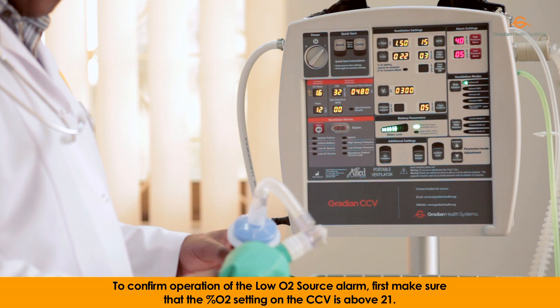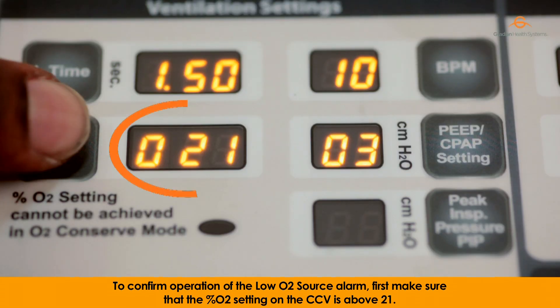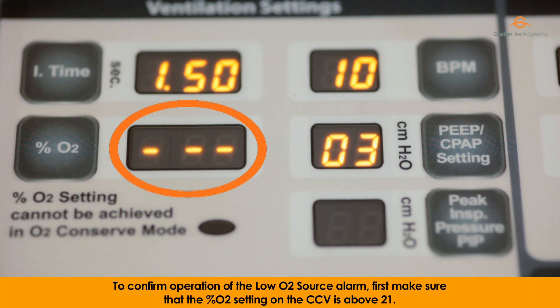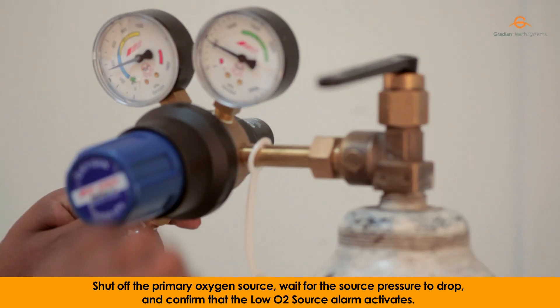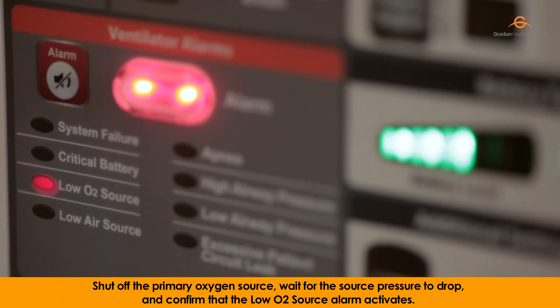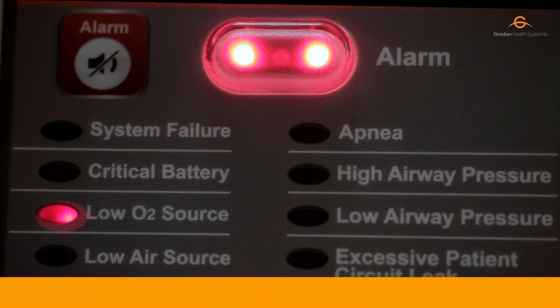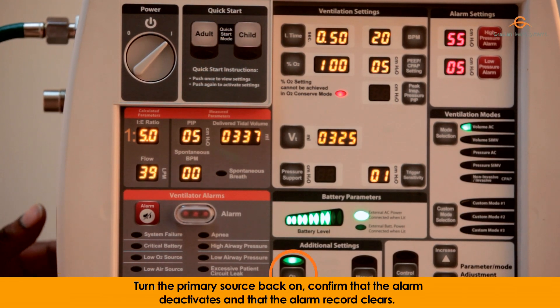To confirm operation of the low O2 source alarm, first make sure that the percentage O2 setting on the CCV is above 21. Shut off the primary oxygen source, wait for the source pressure to drop, and confirm that the low O2 source alarm activates. Turn the primary source back on, confirm that the alarm deactivates and that the alarm record clears.